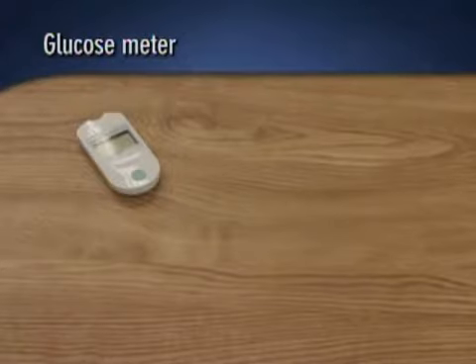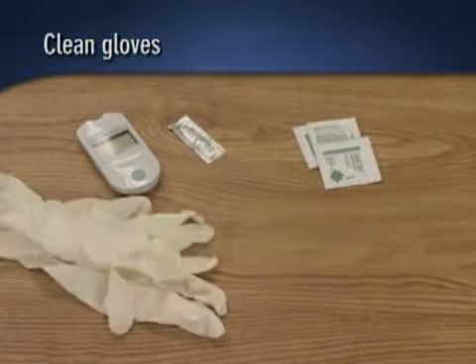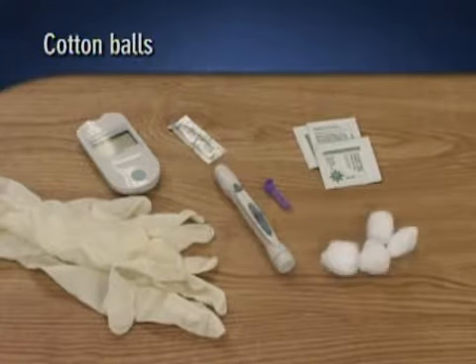We'll assume the nurse has checked the provider's orders, verified the client's identity, explained the procedure to the client, and reviewed the institution's protocols as well as the manufacturer's instructions for using the device. First, the nurse assembles her equipment: the glucose meter, a glucose reagent strip, an antiseptic pad, clean gloves, a sterile lancet, a lancet injector, and cotton balls.